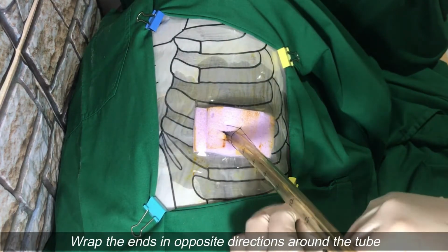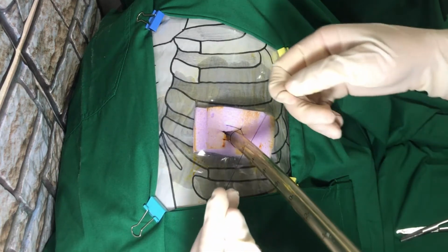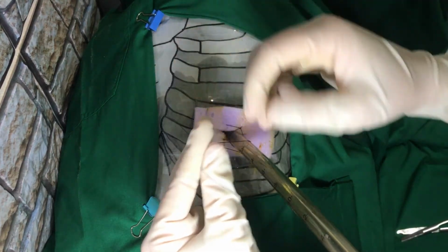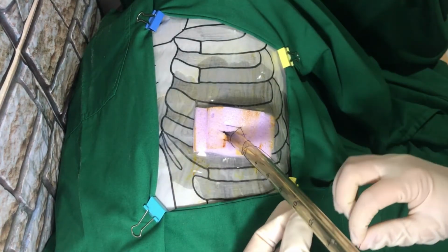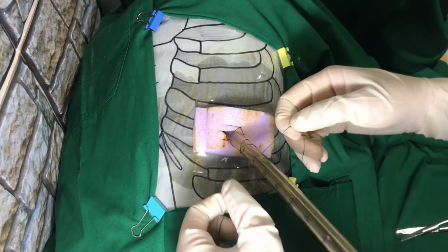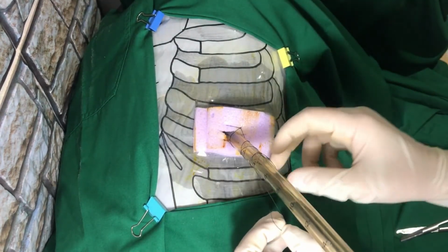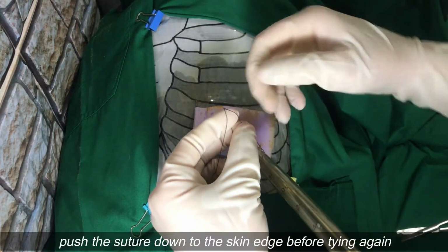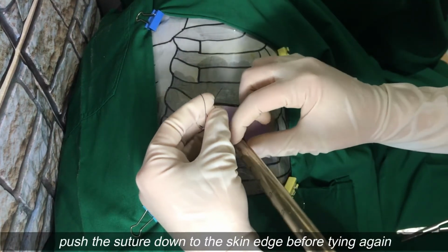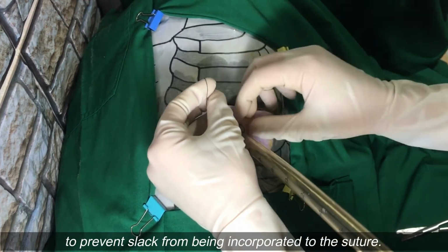Wrap the ends in opposite directions around the tube to form a series of X's. Push the suture down to the skin edge before tying again to prevent slack from being incorporated to the suture.